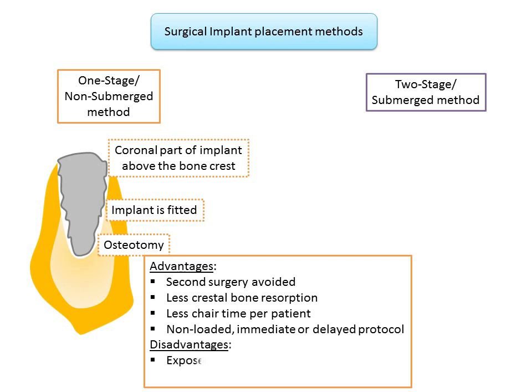One of the drawbacks that may be associated with this surgical protocol is that the implant is exposed to the oral environment, which may lead to contamination of the surgical site. Furthermore, the implant may be exposed to undue trauma, which can negatively affect the healing. Nevertheless, the method can be clinically successful.